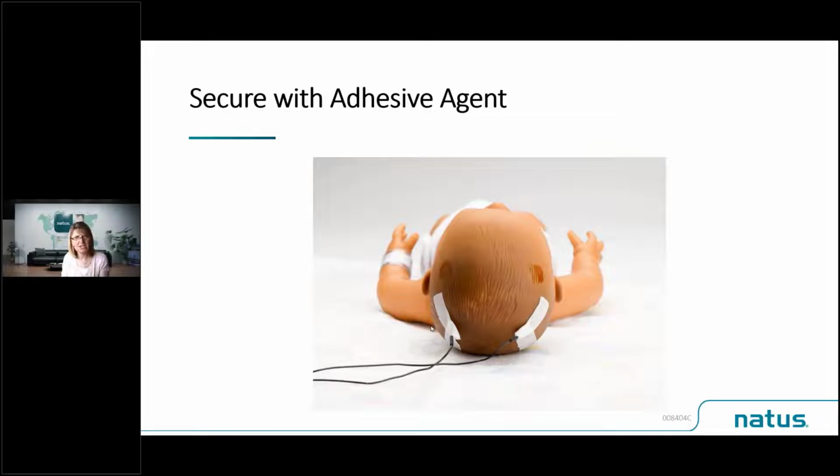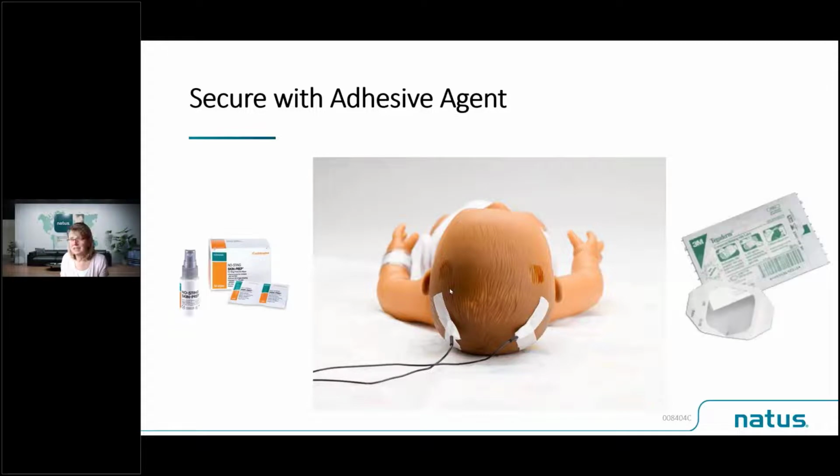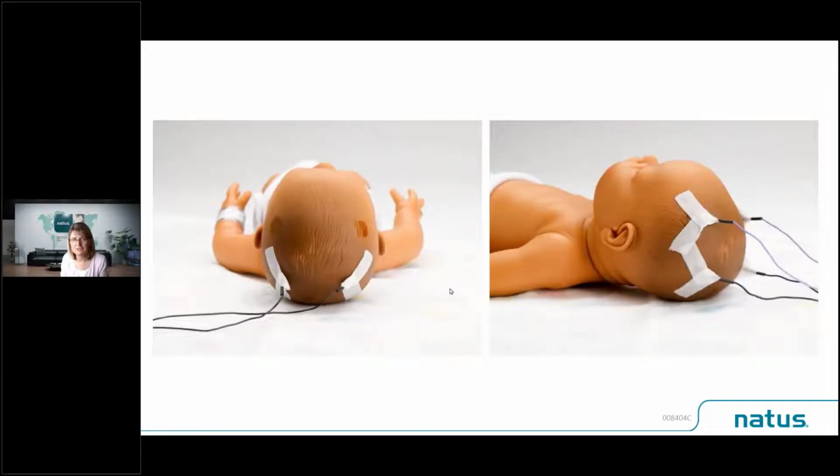Some clinicians actually find it quite helpful to part the hair and mat the hair down with some kind of water-soluble lubricant or preparation like skin prep, skin tack. You can put this on the hair and mat the hair down, and then that helps you with applying the adhesive paste or adhesive tape, I'm sorry, or Tegaderm, whatever it is that you're choosing to actually use.